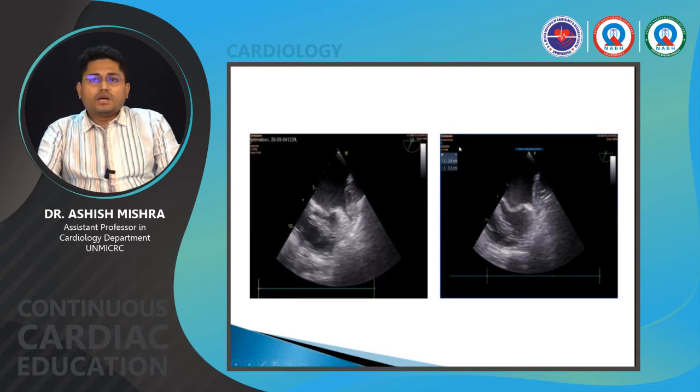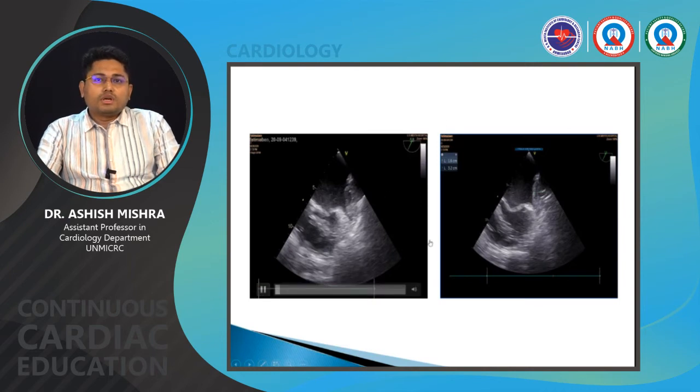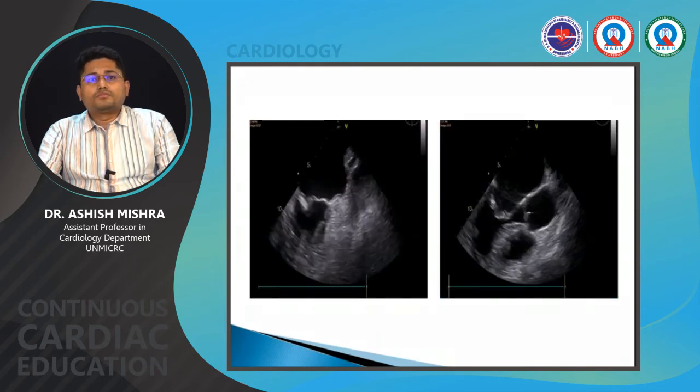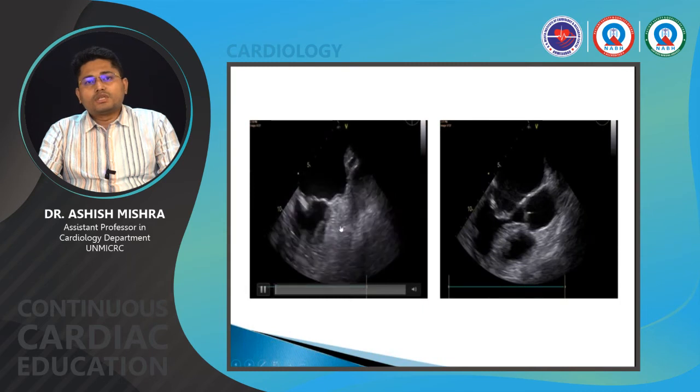So TEE can also help plan various procedures. In this case, we backed off, and this patient was given an anticoagulation trial and follow-up to see for LA clot resolution. Now this is again an interesting view from a patient with severe critical MS.